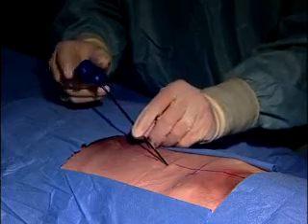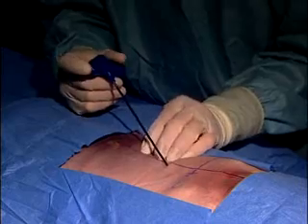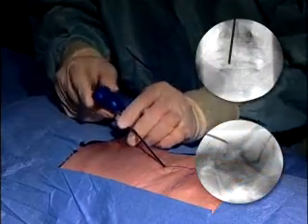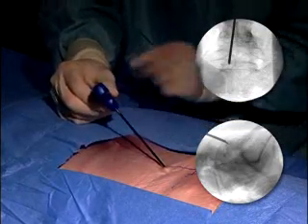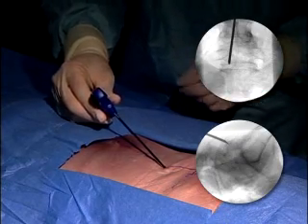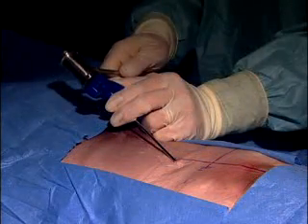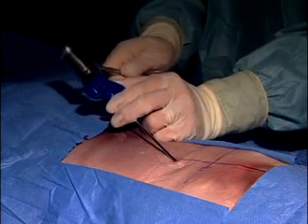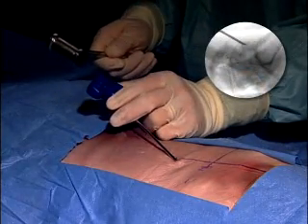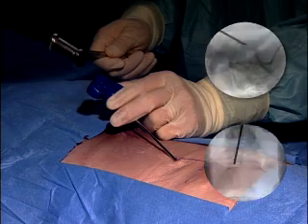The access needle is inserted, with the bevel facing up through the skin along the proper trajectory until the tip is at the start point on the bony anatomy. A series of AP and lateral views may be needed to confirm precise positioning. Once the start point and trajectory are confirmed in the lateral view, the access needle is tapped into the bone. The surgeon may decide to verify placement and trajectory with an AP fluoroscopy image.